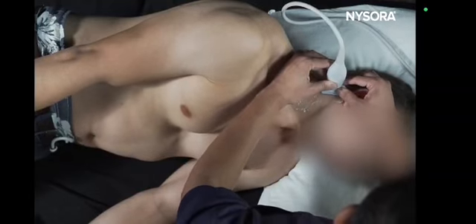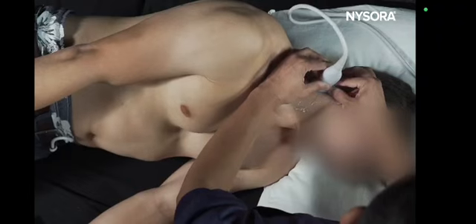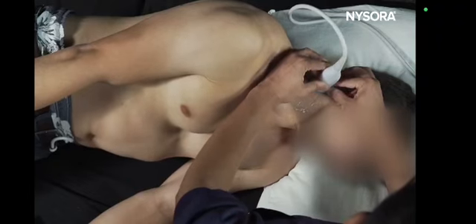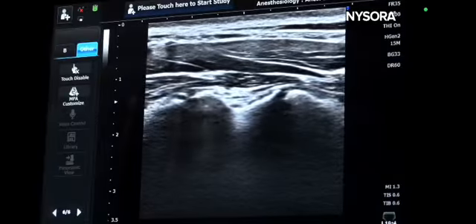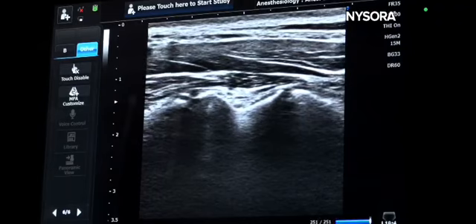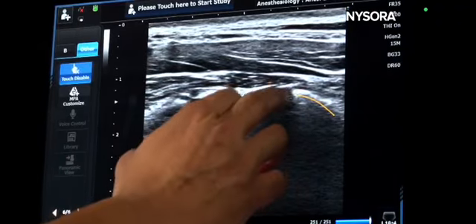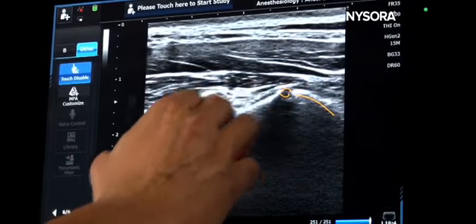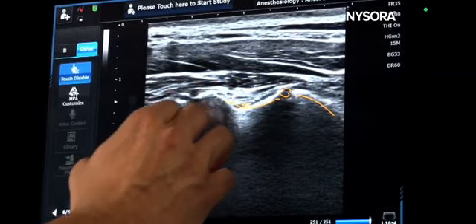So we'll go back again and I'll show you the whole cervical medial branch and the facet joint column in one view, and now you can see the whole image quite nicely shown here. And I'm going to freeze this and I'll explain the peak and trough structures. So here we have the peak, and the peak is where you have a joint, and then you have a trough. The trough is where you have a medial branch.